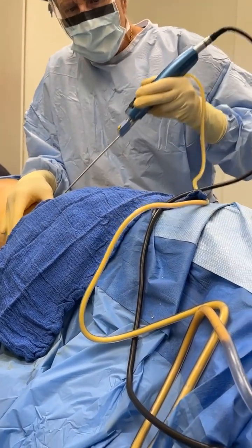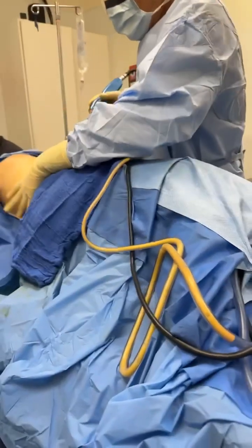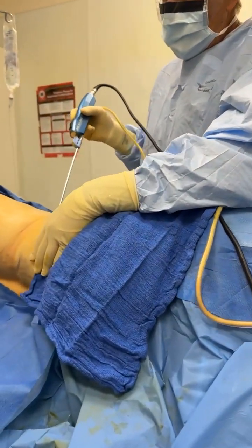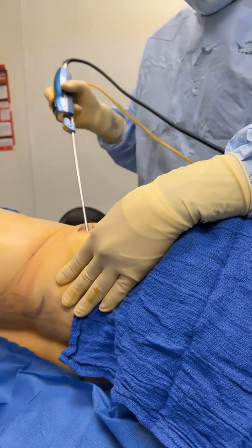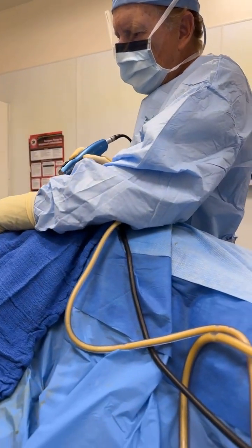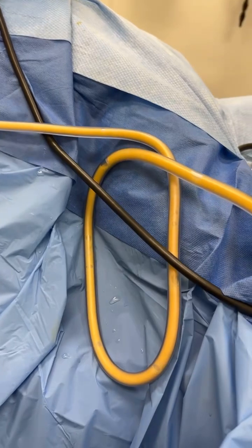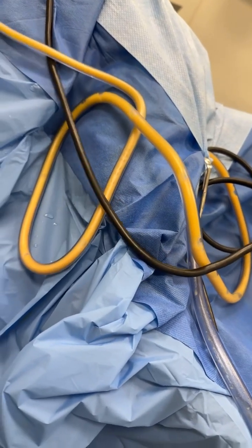And so there's much less risk of oil cysts because we also use an aspirator at very low power. So now I'm switching to my right hand. Advantages for the patient, right? When you go slow like this, it's like driving a car. What's the risk of me perforating an organ if I go at this speed? It's almost zero, right? And that has never happened, right?